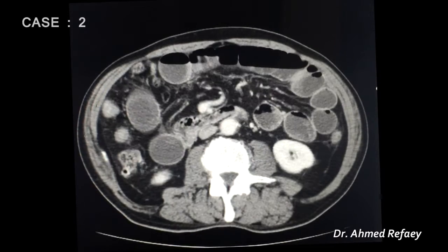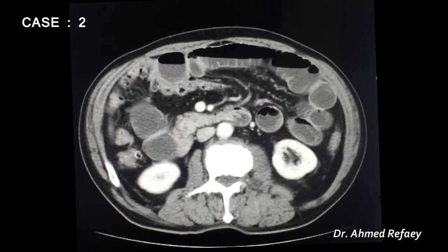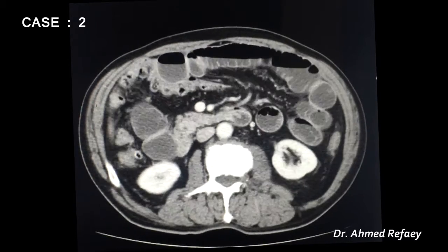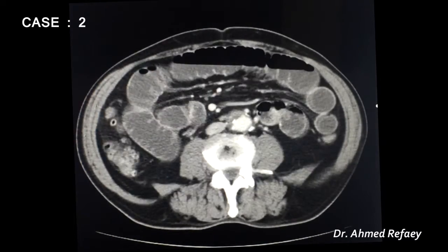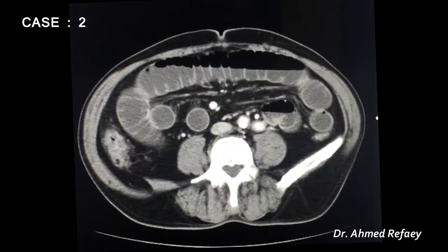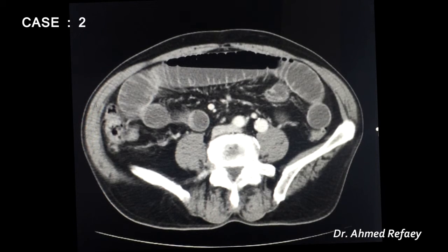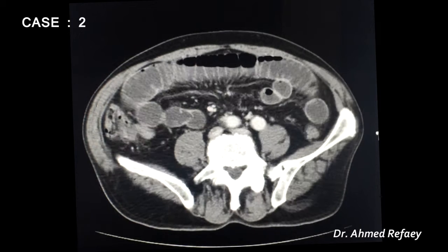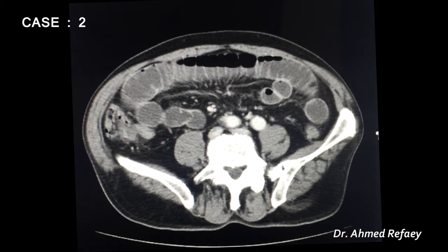Case number two: a 50-year-old male referred for CT abdomen to rule out intestinal obstruction. The study was performed with intravenous contrast and no oral contrast.